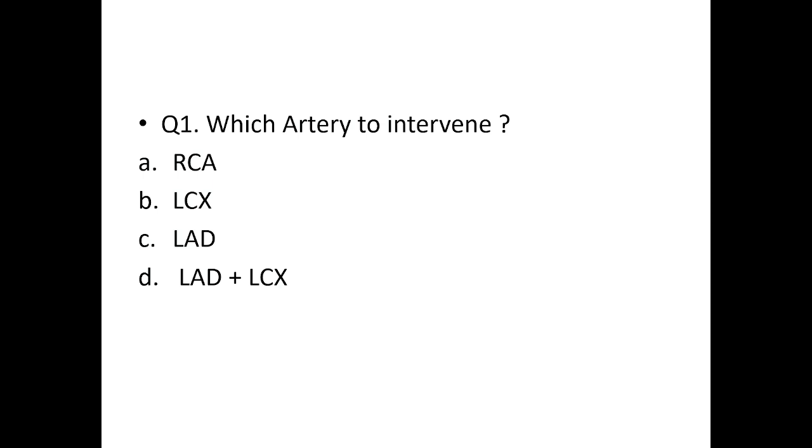STEMI anterior. What was the time period between the STEMI and the angiogram? Sir, it was 3 weeks back, and the patient was suffering from angina. Recent MI, LAD totally occluded, sir. 3 weeks.